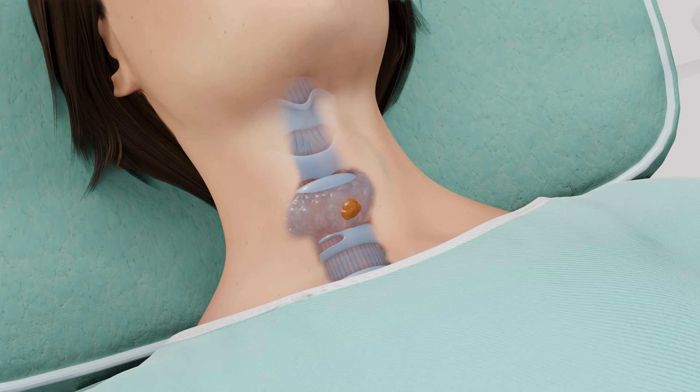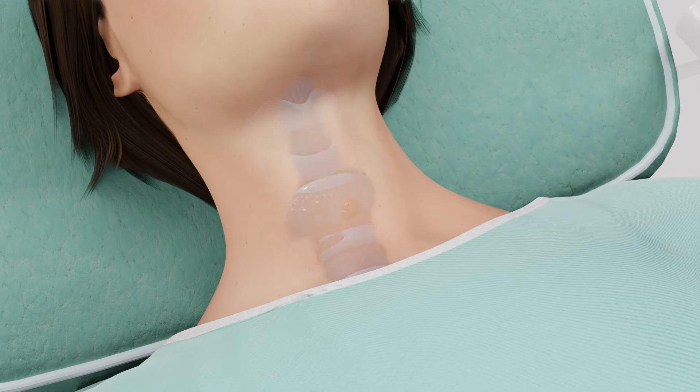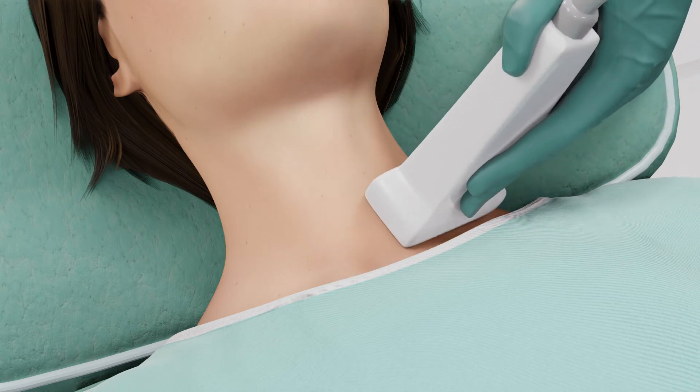The thyroid capsule has sensory nerves that can feel pain. Some numbing medication may be administered before local anesthesia is injected into the skin with a thin needle. You may feel a prick when the local anesthesia is injected.